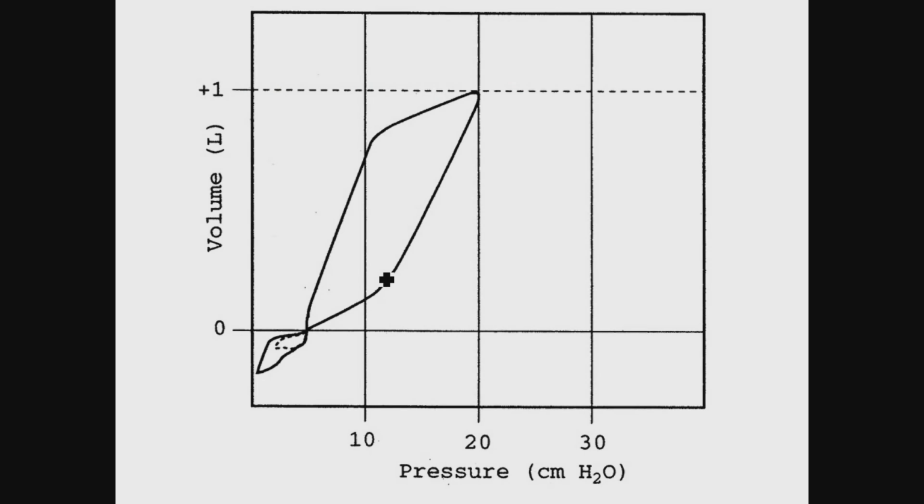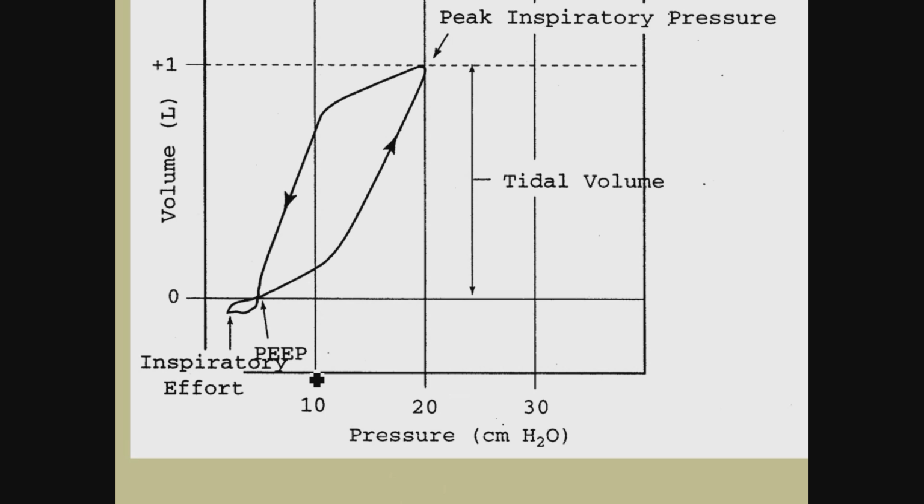And just looking at a mechanical breath, here this patient is on 5 of PEEP, right? They're drawing back excessive amounts of pressure before that breath begins. So again, inappropriate sensitivity setting. It's just kind of breaking that out. That negative pressure that is created is the inspiratory effort prior to the breath being delivered.